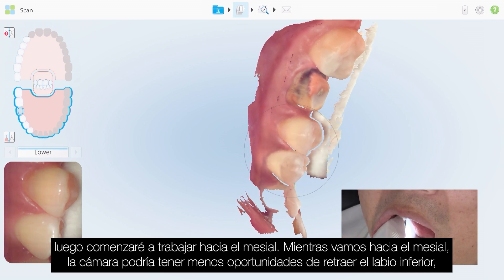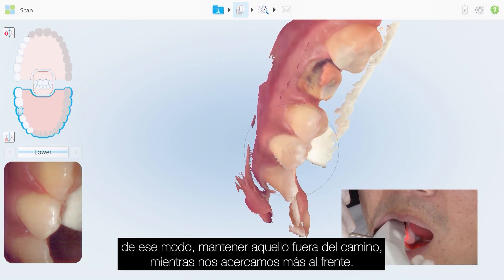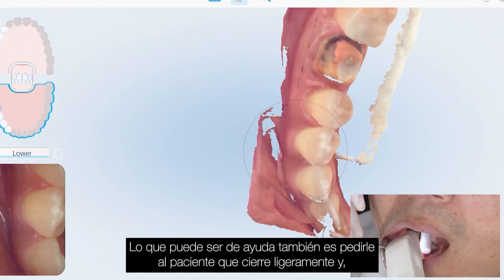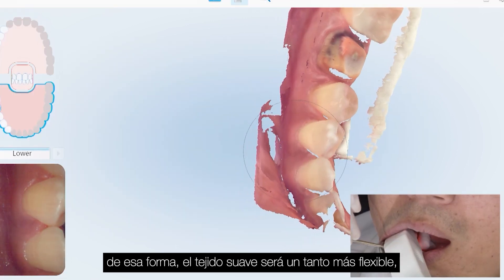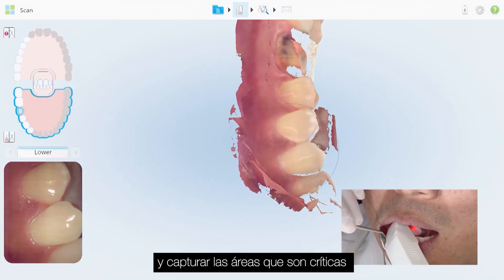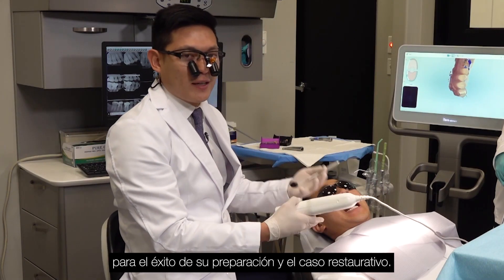As we go toward the mesial, the camera may have less of a chance of retracting the lower lip, so you may need to use either your finger, a mirror, or some type of retraction aid to keep that out of the way. Asking the patient to close slightly helps, as the soft tissue becomes more movable so you can maintain that rotation to the buccal and capture the areas that are critical to the success of your preparation and restorative situation.